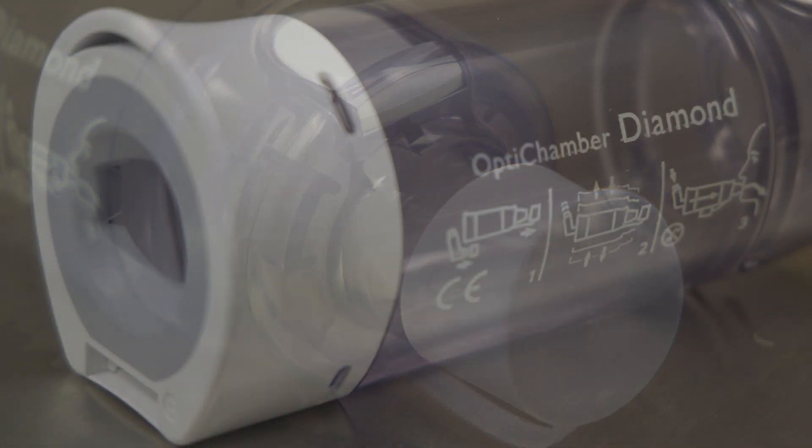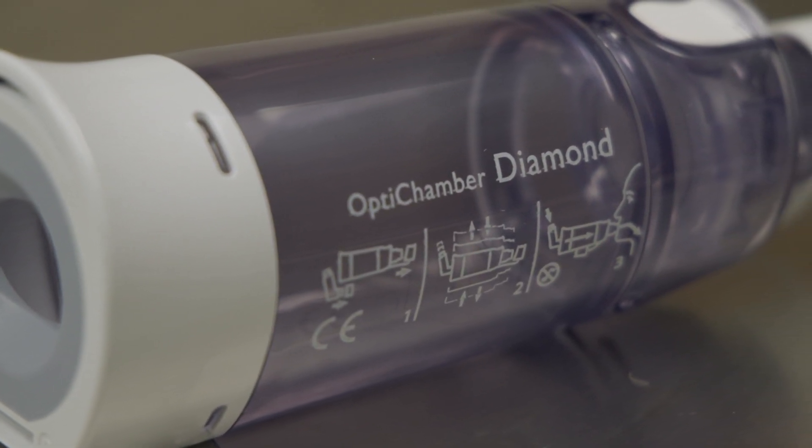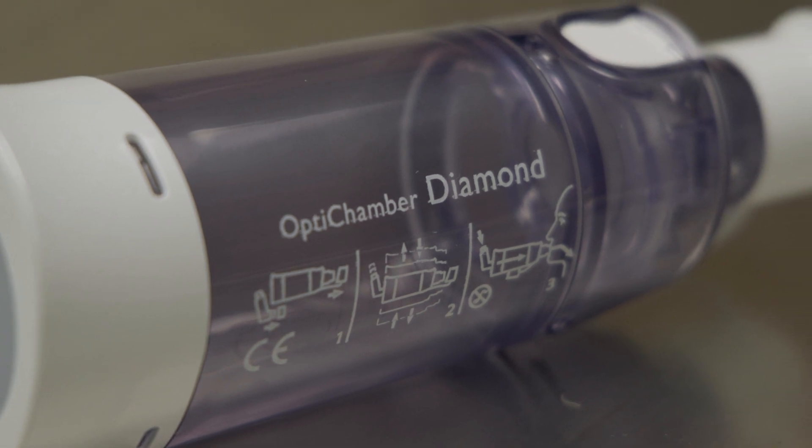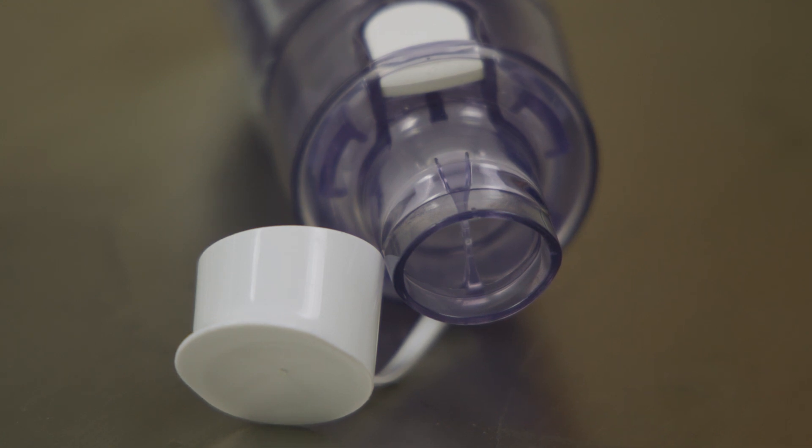If this spacer is not used, the medication may not get to the lungs and can't do its job. The spacer allows for the medication particles that have left the canister to be held in the chamber for three to five seconds.